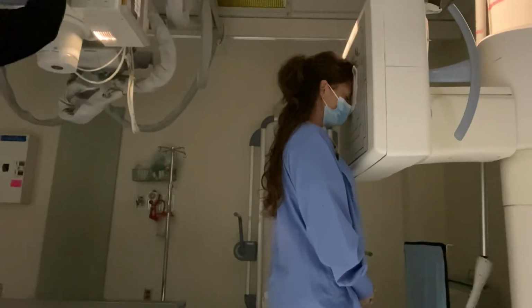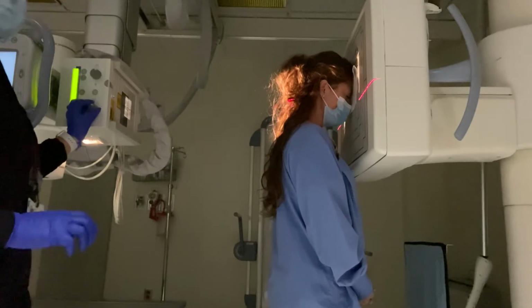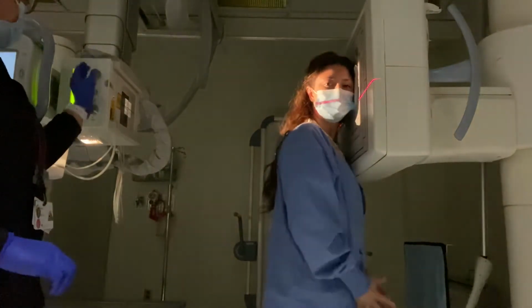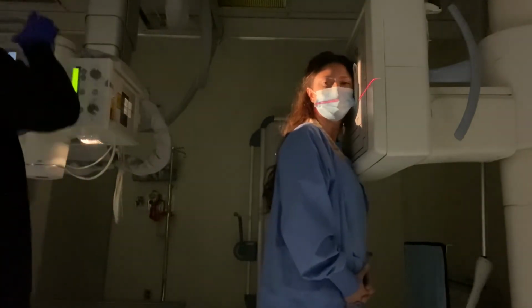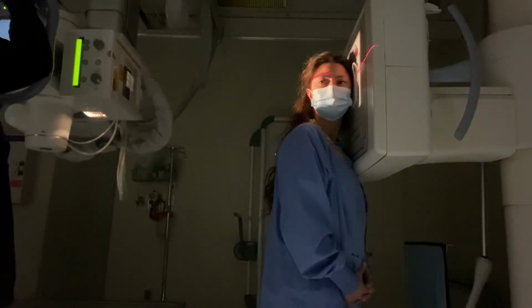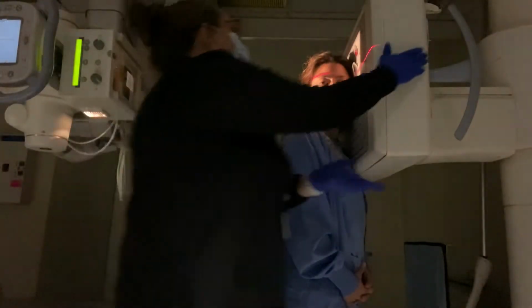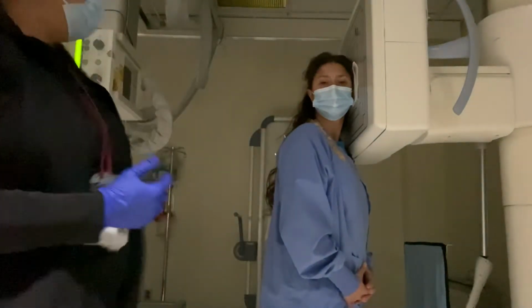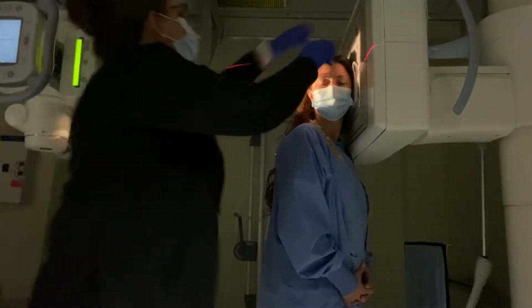All right, and then I would go into my lateral. So for all of the images, you're going to be 10 by 12 lengthwise, except for the lateral, which then you're going to be crosswise. So I'm going to turn my image. My central ray is going to be 2 inches directly above the EAM. And we're doing that to ensure that we get light above the top of the skull. This is going to raise up. Usually we do the affected side. I'm going to do the right side or the left side just to make sure that you can see everything.